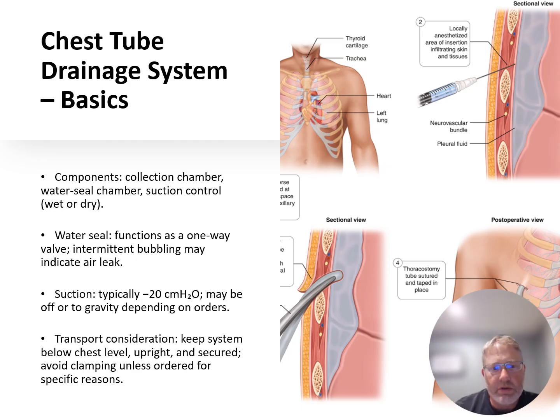The water seal chest tube drainage system. I remember learning about that back in school many years ago, and it always confused me. So here I am talking to a computer and trying to explain it to the ether. But here goes nothing.